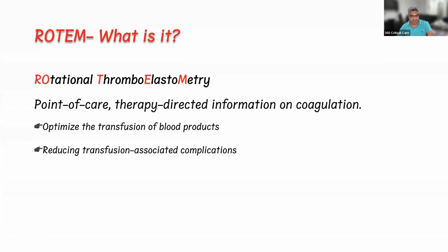Okay. Good evening, everyone. As was being said, this is a very important topic, and a bit confusing also. In the exam, the expectation is that they will be giving you a picture of a ROTEM, and they will be asking you about your interpretation or your management plan.